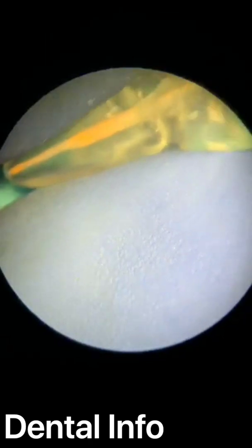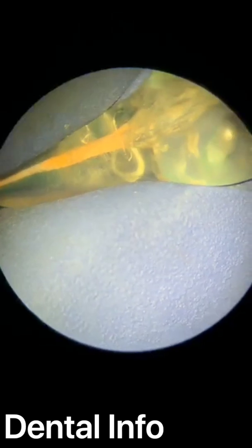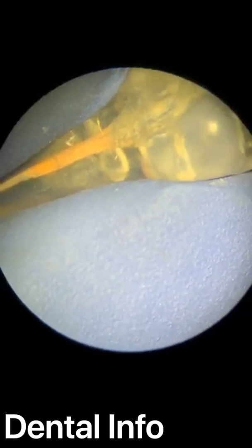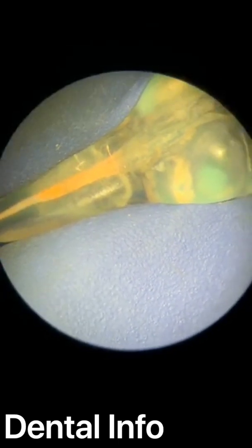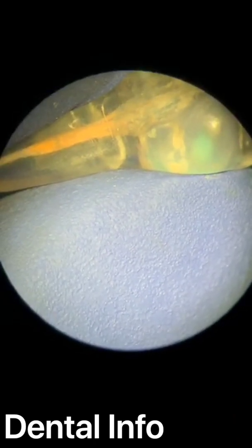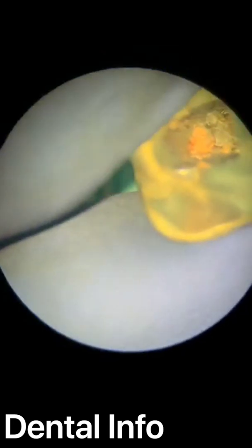Then I will take it again and put another 1 or 2 millimeters, enough. I will go and I will condense. Some people stop here. They don't fill the canal more. But for me, I will fill it more just to show you more how we're using this amazing device. The last layer, I will show you how I'm condensing it occlusally. We have an occlusal view here.